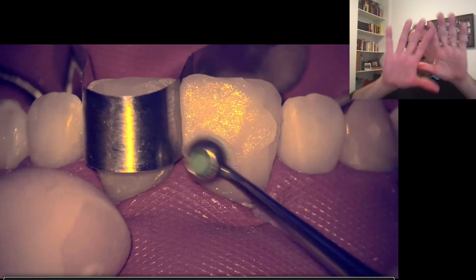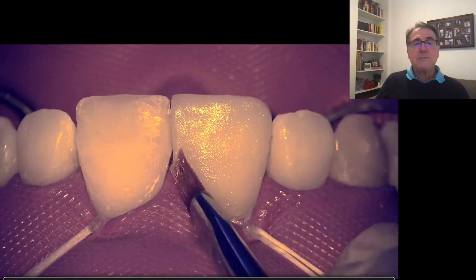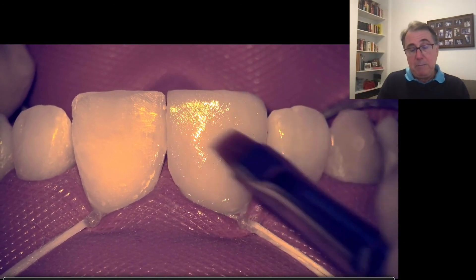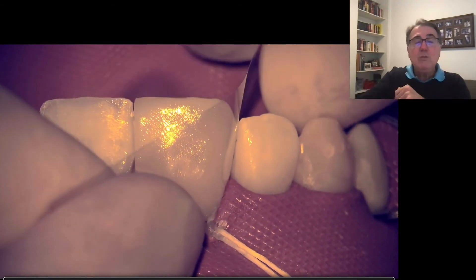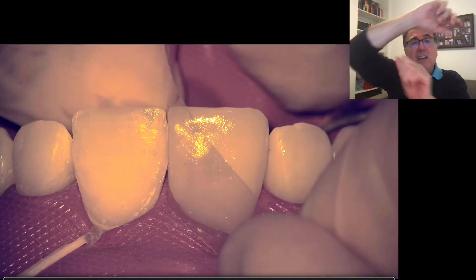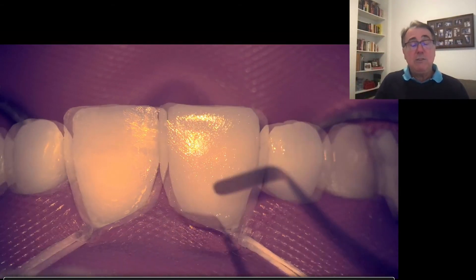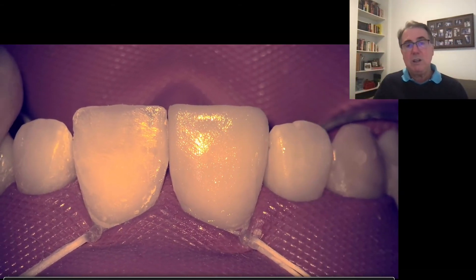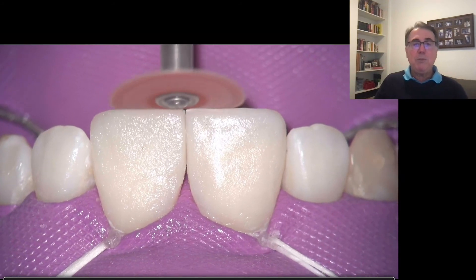I pull the matrix — it could be a mylar matrix or a metal strip — from buccal to palatal surface, and while I do that I make a movement to create the proper contour of the proximal surfaces. I did one central and now I'm going to finish the other one. After that, we're going to start our finishing and polishing. We start always with the discs — these are the Sof-Lex discs from 3M — using all those discs to create the proper anatomy.